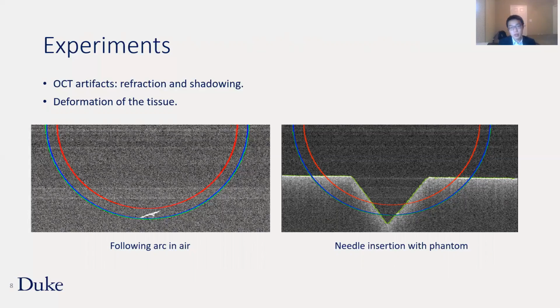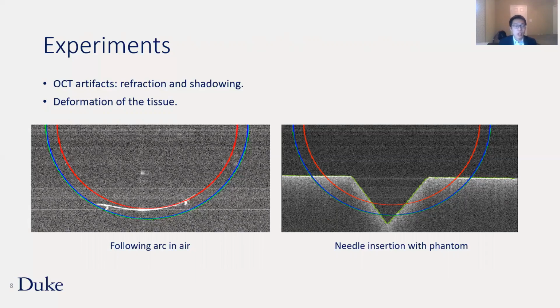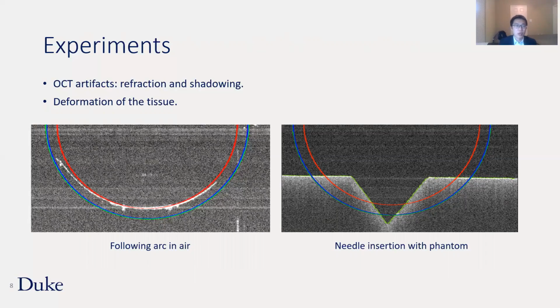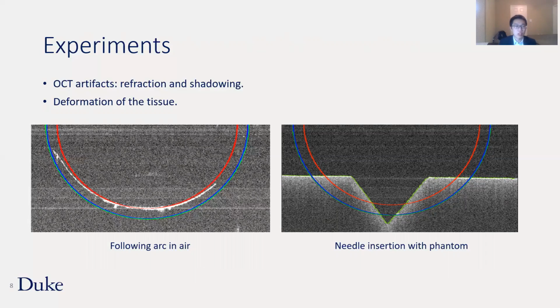The blue curve is the desired outside surface path. But we can never see the outside surface because the laser cannot go through the metal. From this video, we can see that the needle follows our desired suturing path with relatively low error.